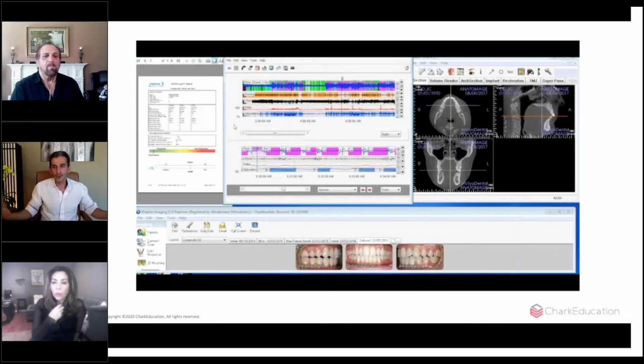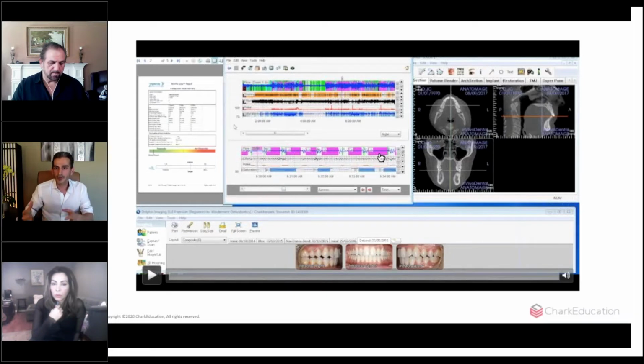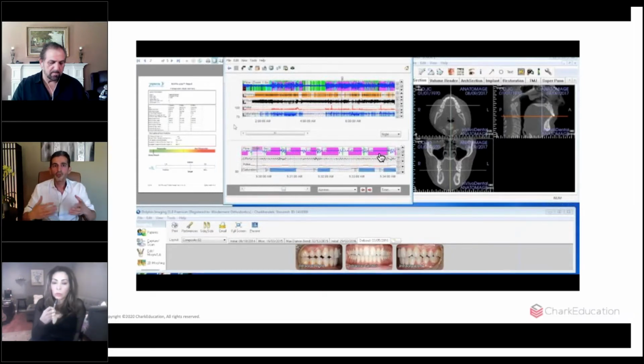Well, we do records. We do diagnostic records. What does a prosthodontist do? Diagnostic records. What does a periodontist do? Diagnostic records. What are the diagnostic records for perio? Your models, your pictures, also your pocket depth, also your overall periodontal health. The same thing needs to happen for a sleep appliance. We do our models digitally, but we do gather the data.